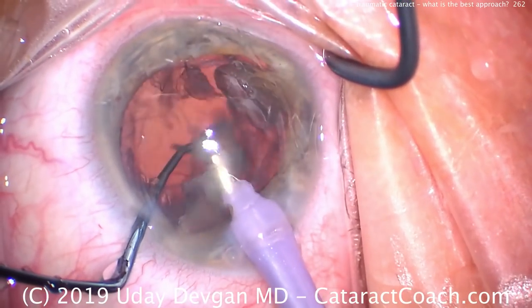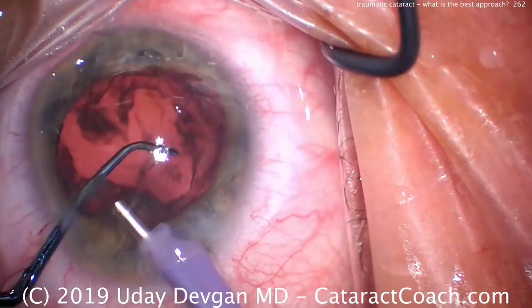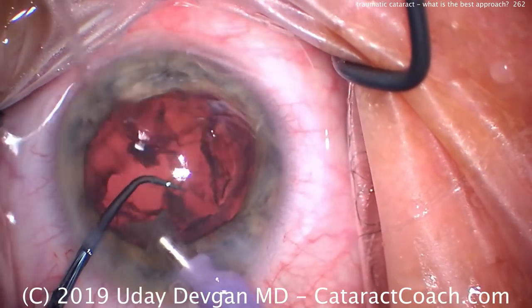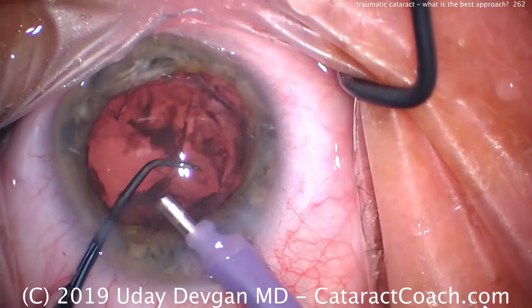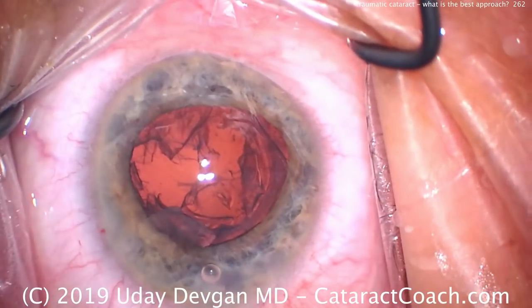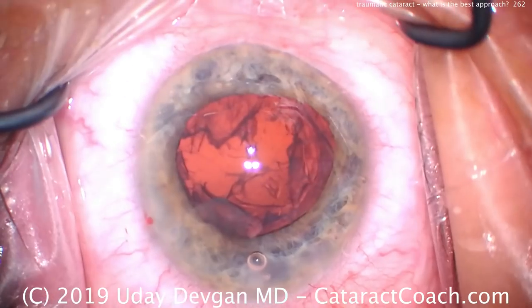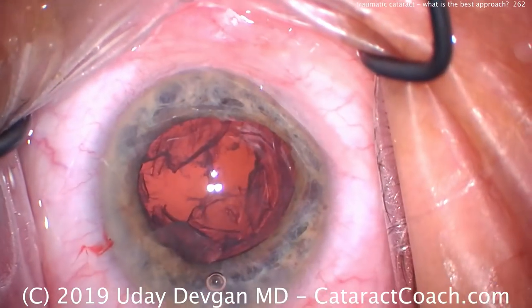All looks pretty good so far. I'm also looking at the posterior capsule. Looks like it's intact. Looks like we may get lucky in this case. So let's take down the last nuclear piece here. Chopper's in a protective mode. Again, we haven't seen the lens capsular bag equator, which is a good sign. So we got out the nucleus, maybe a couple of chunks left. We'll get those out later.